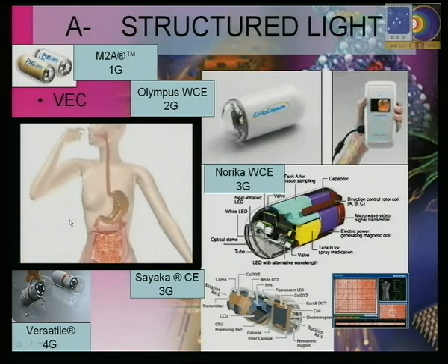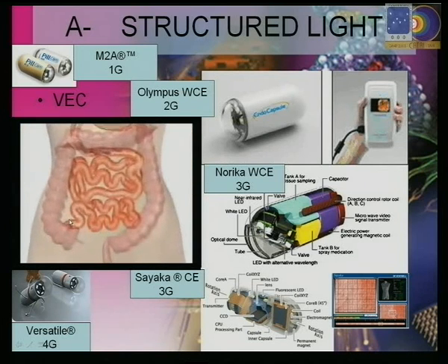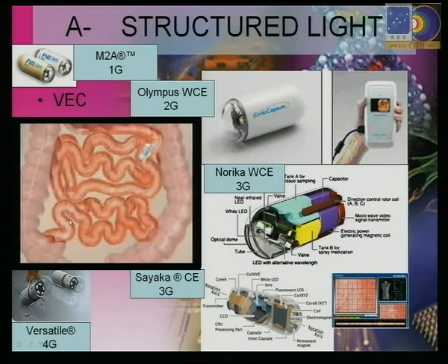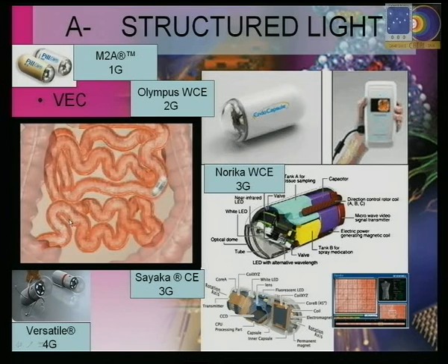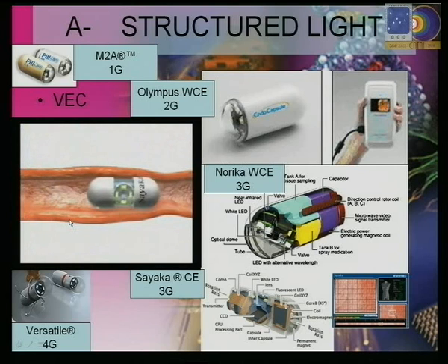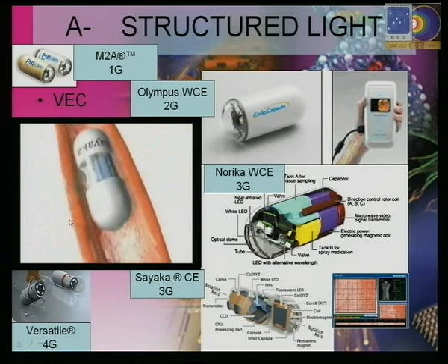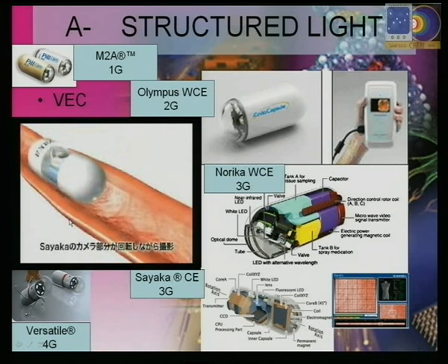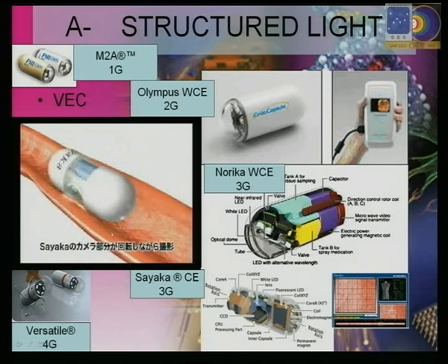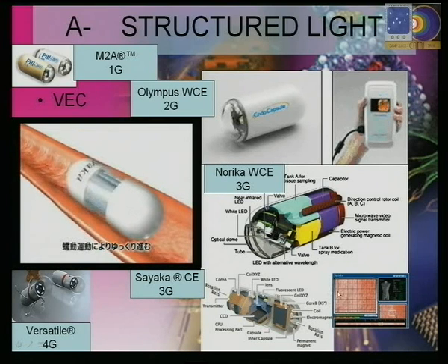Esophagus, stomach, also you get lost more or less, although this pill is tracked from the outside, so you can move it in such a manner that you can push it on the lateral walls and therefore take better pictures. But obviously in the small intestine it is very fine because the walls of the intestine are touching the surface of the pill. You are taking pictures all over around, and thereafter you build a mosaic, like here. You stitch and build a mosaic.